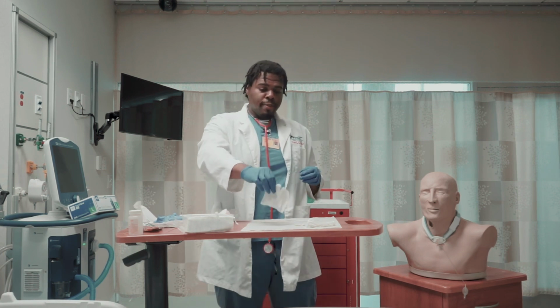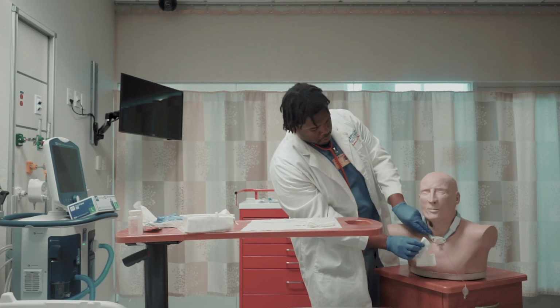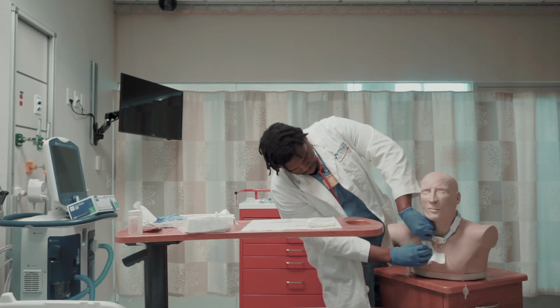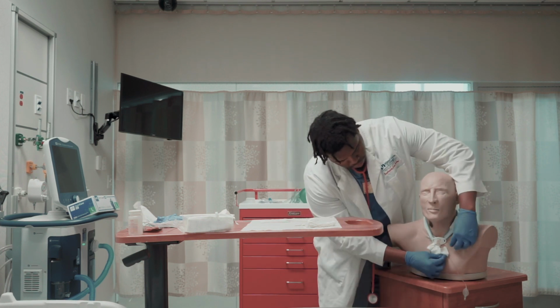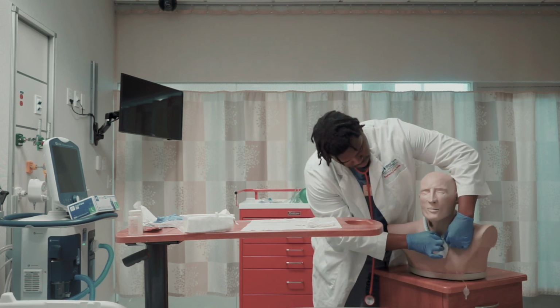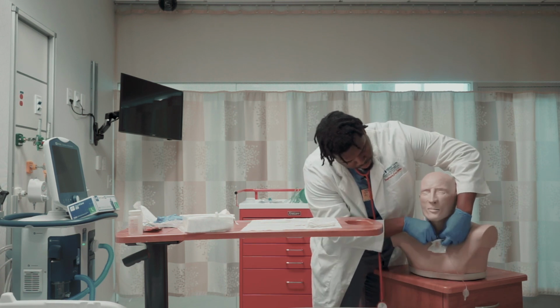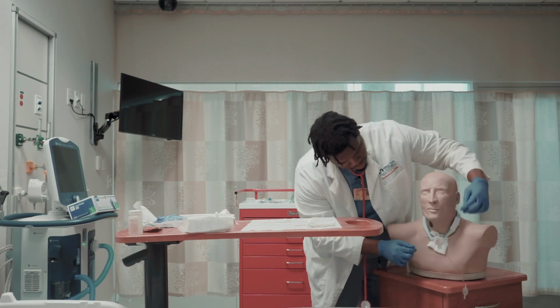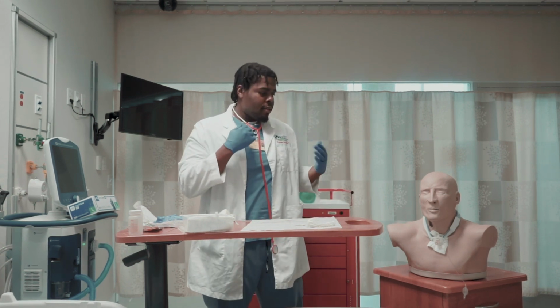Put on a new dressing. Now I'm going to auscultate, check for airway patency and his vitals.